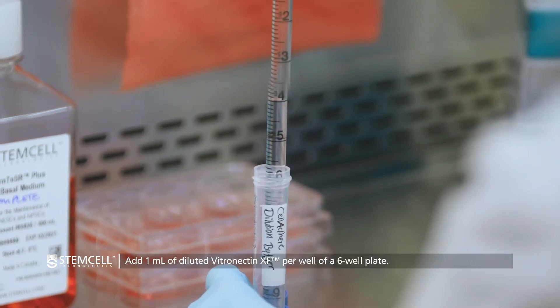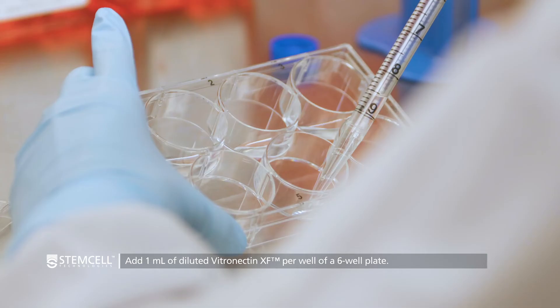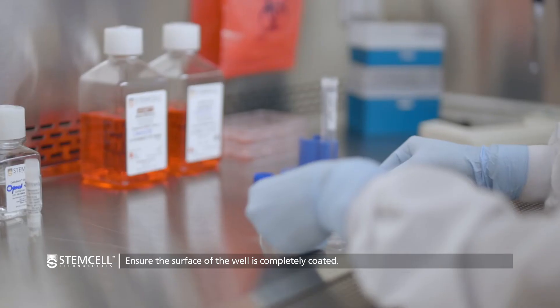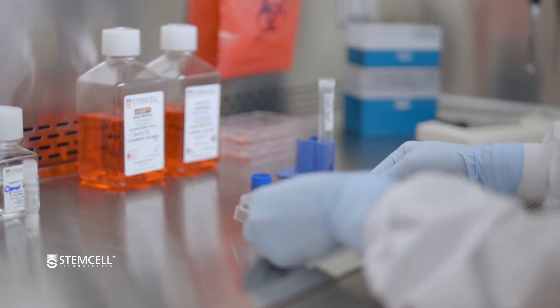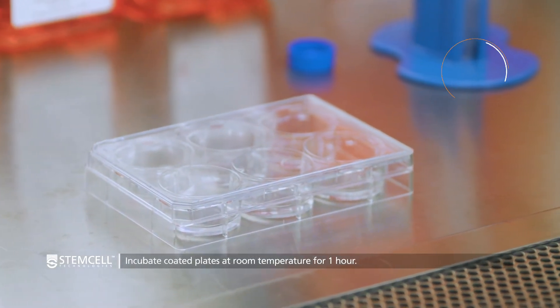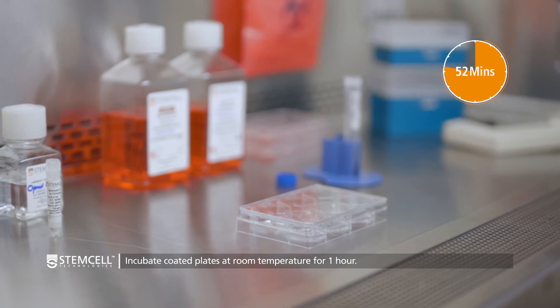Add 1 milliliter of the Vitronectin XF solution to each well of a non-tissue culture-treated 6-well plate and gently rock the cultureware back and forth to ensure that the solution has evenly covered the entire surface of the well. This may take about 30 seconds as there will be steric hindrance between the non-treated plastic and the solution. Incubate the plate at room temperature for at least 1 hour before use, ensuring that the Vitronectin XF solution does not evaporate.